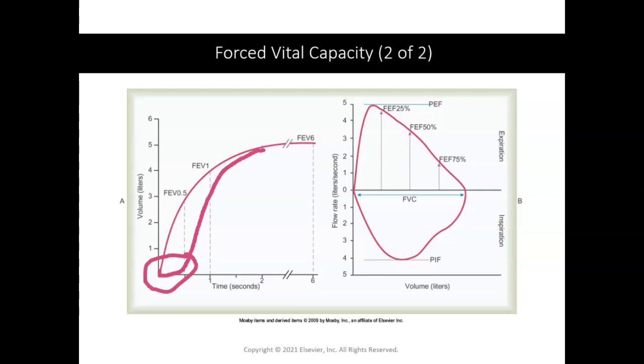And typically how I fix this with patients is what they're doing is taking that big deep breath in and then holding their breath, kind of doing a breath hold pause at that peak inspiration. And then sometimes a little bit of the air leaks out while they're holding their breath there, and that causes this extrapolation and invalidates your results. Okay, so that's what you're looking for in this volume time scalar. Mostly I'm troubleshooting for that extrapolation.